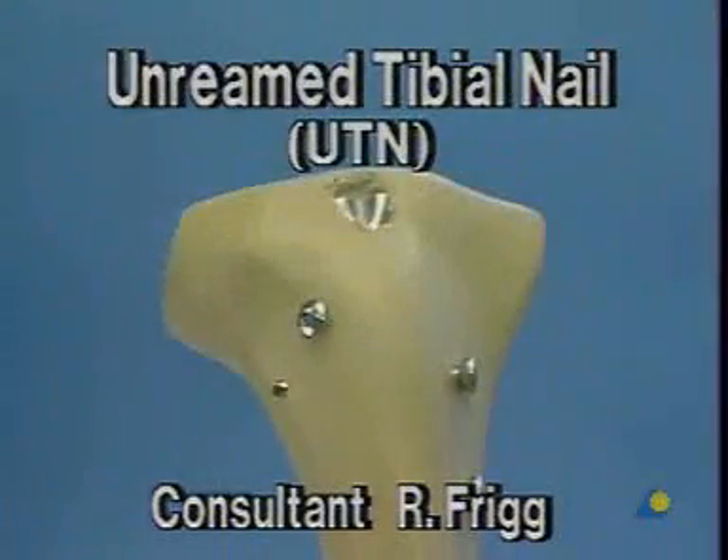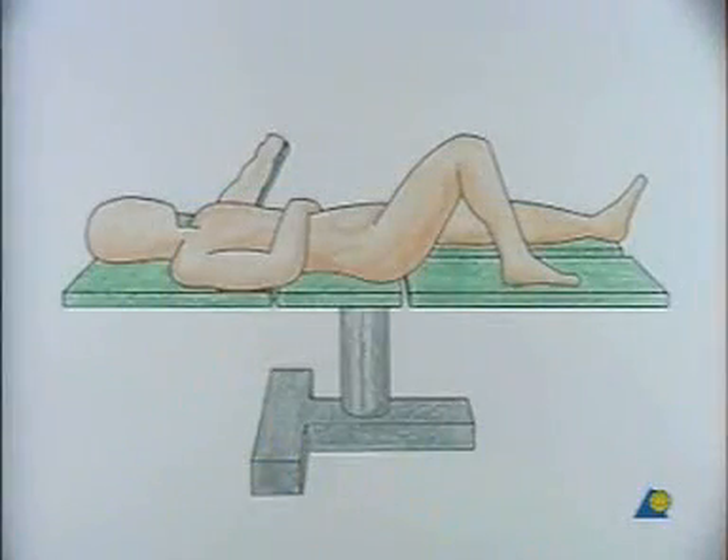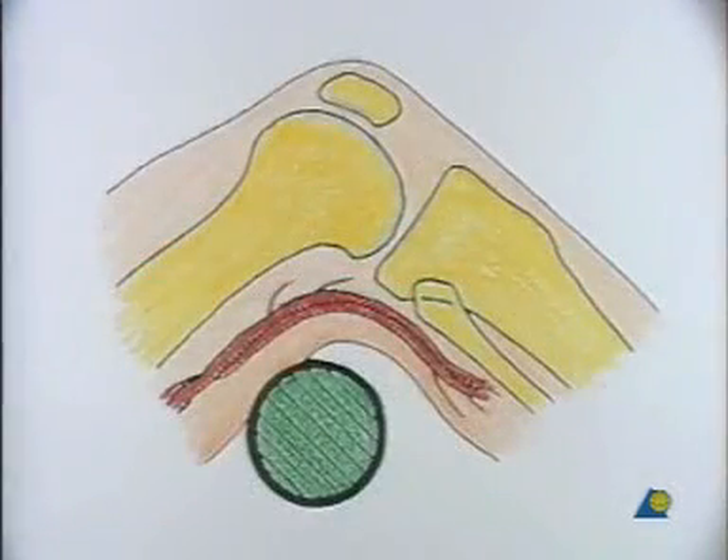Unreamed tibial nail (UTN). To carry out intramedullary nailing with the unreamed tibial nail, the knee must be bent at an angle of at least 90 degrees, so that by opening the medullary canal and during insertion of the unreamed nail, the patella is not injured.